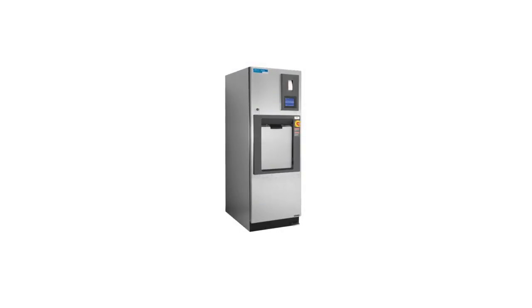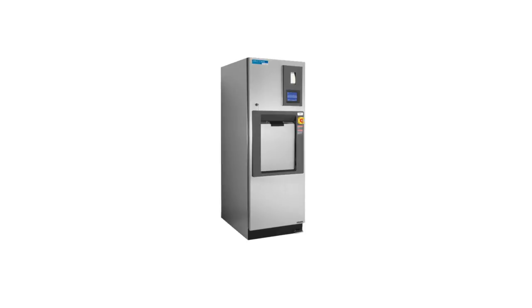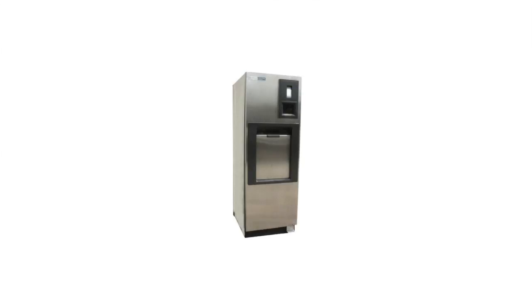The Steris Amsco Century V120 is a touchscreen-operated, easy-to-use sterilizer. Its operating temperature ranges from 212 to 285 degrees Fahrenheit and has a chamber size of 20 by 20 by 38 inches.